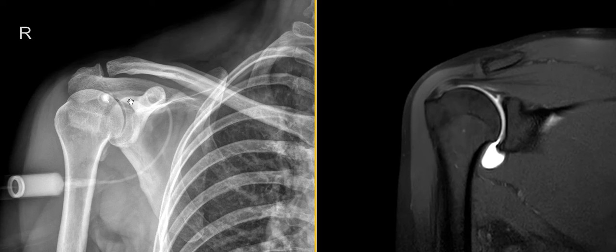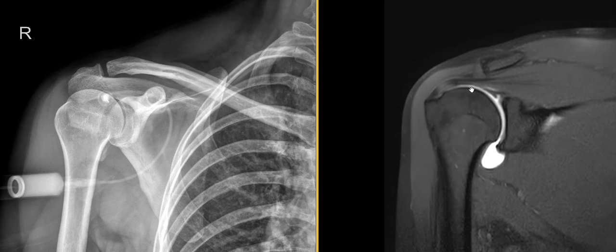We'll just let all that contrast fill up the joint, then clean them off, send them over to the MRI machine, and then we'll do the MRI. Now the MRI machine has the joint filled with contrast — the structures are distended and the contrast is very bright on a particular sequence. This is a T1-weighted sequence, and normally fluid is dark on T1, but with the contrast it's the opposite — it's light-bulb bright. And if there's a tear of the labrum, which is a little cartilaginous wedge up here that goes all the way around the rim of this cup of the shoulder joint, the contrast may go into it just like this and we'll be able to see the tear really easily.